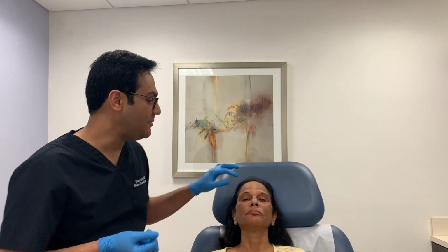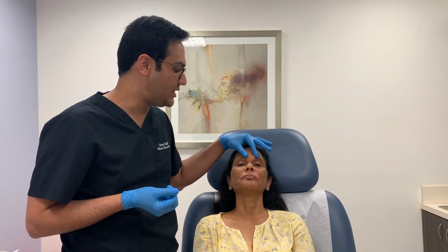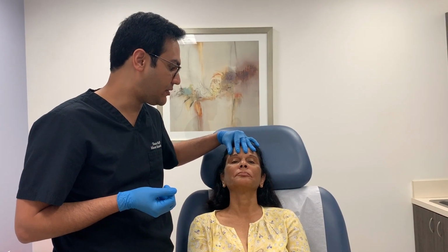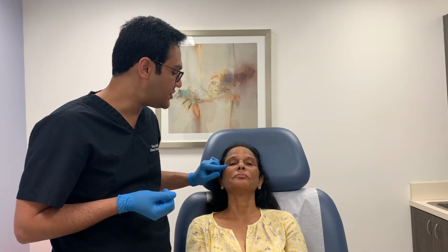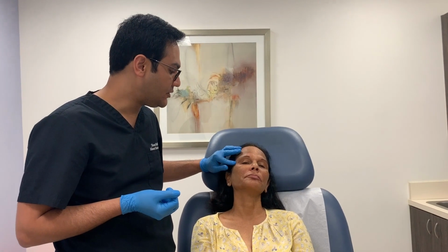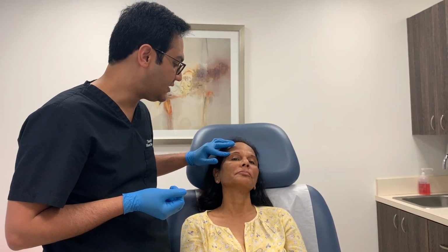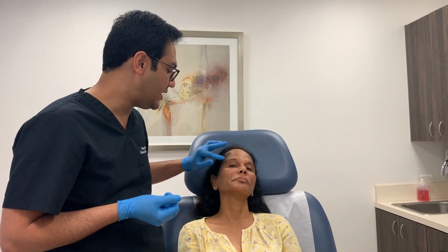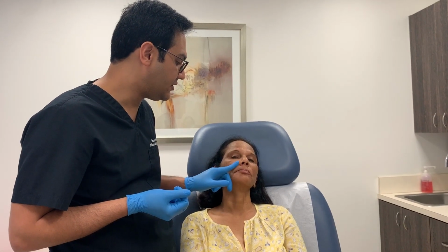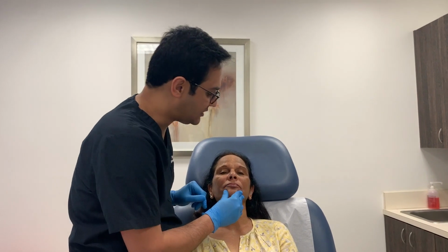So that's a complete treatment. What we did today, to summarize, was I injected Dysport between the eyebrows, on the forehead, a very low dose because I didn't want to make her forehead appear heavy. I injected Dysport around the eyes to open up her eyes. I treated her temples with hyper-dilute Restylane Defyne. I injected her lateral brow, the upper lid, as well as the temples with the Restylane Defyne. I treated her nasolabial folds with Restylane Refyne. I also put a tiny bit of Restylane Refyne at the corners of the mouth.